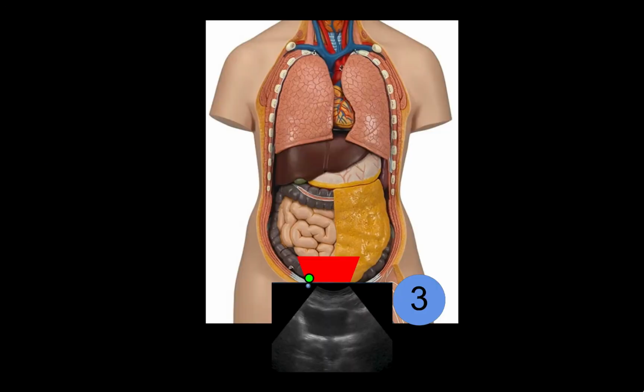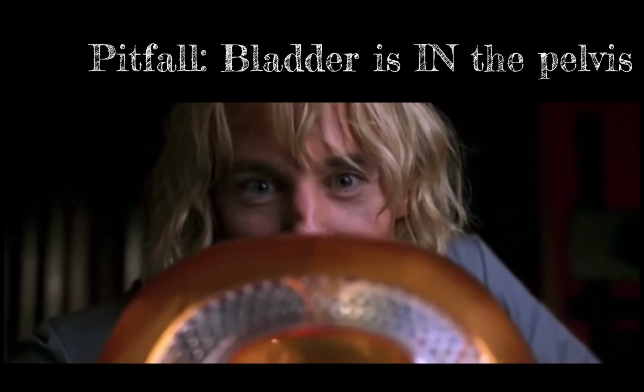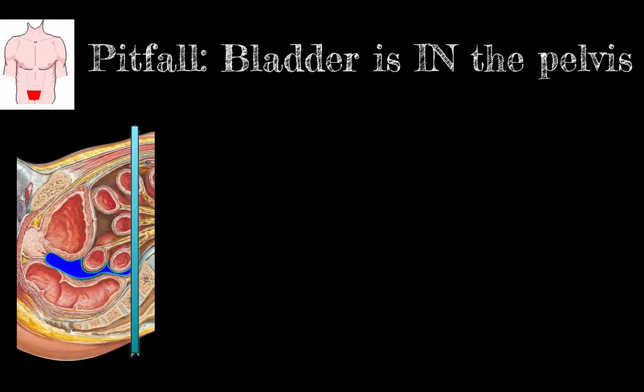Finally, let's look at the last, most dependent part of the abdomen, the suprapubic region. Your landmark organ here, like the liver and the spleen of the upper abdomen, is the bladder. The biggest pitfall people fall into is they don't realize that the bladder actually sits in the pelvis, kind of like those files in Zoolander sitting in the computer. In the computer. It's so simple.